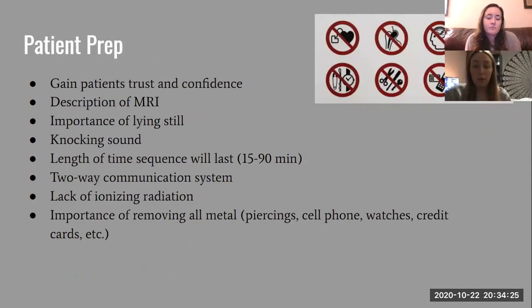Next, I'm going to be talking about patient prep. So just make sure to gain the patient's trust and confidence. Describe the MRI, the importance of lying still. There's going to be a loud knocking sound while they're having their exam. The length of time sequence will last, which is usually about 15 to 90 minutes. The two-way communication system, lack of ionizing radiation, and the importance of removing all metal, so piercings, cell phones, watches, credit cards, etc.